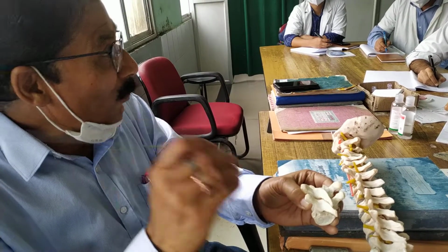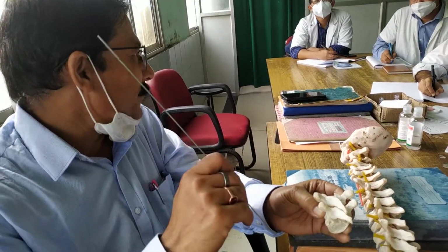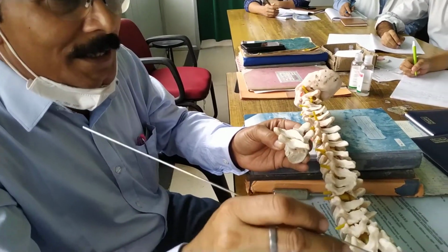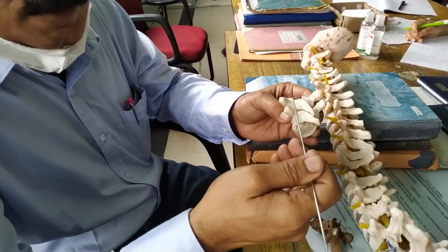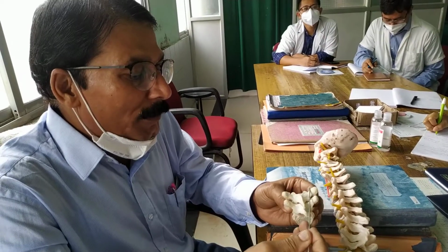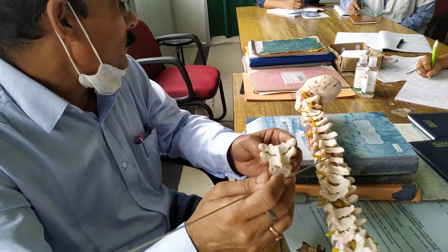Because it is one of the important landmarks in the thoracic area before going for the pedicle screw fixation, you need to find out the joint. So as such, in the prone position, the dissection should be the same, going far laterally to the transverse process. This is important: you have to go up to the transverse process. And it is always important to do a very good dissection, very good dissection up to the tip of the transverse process.